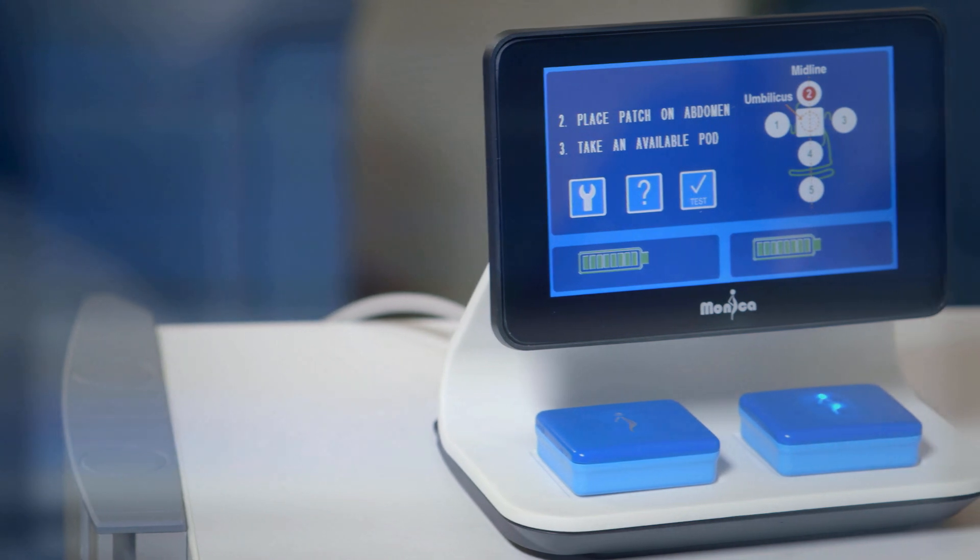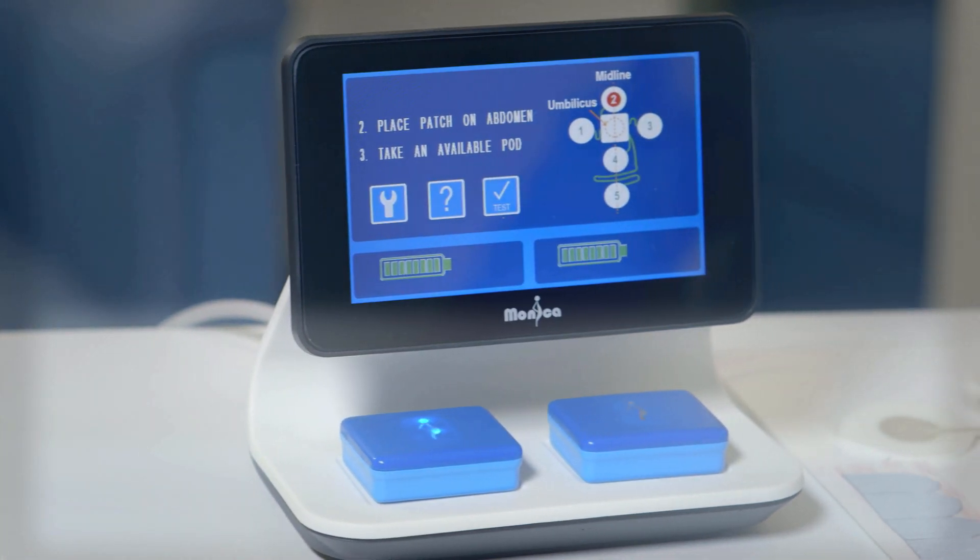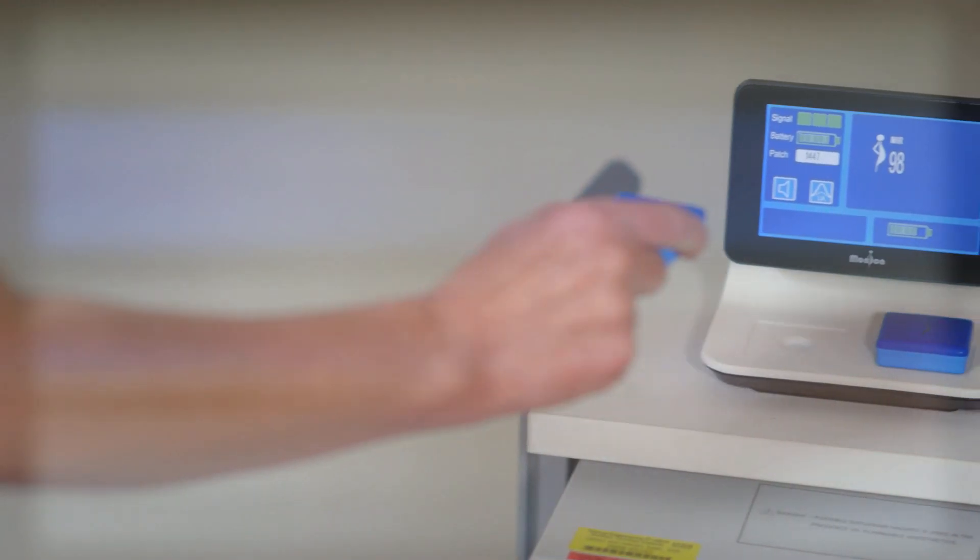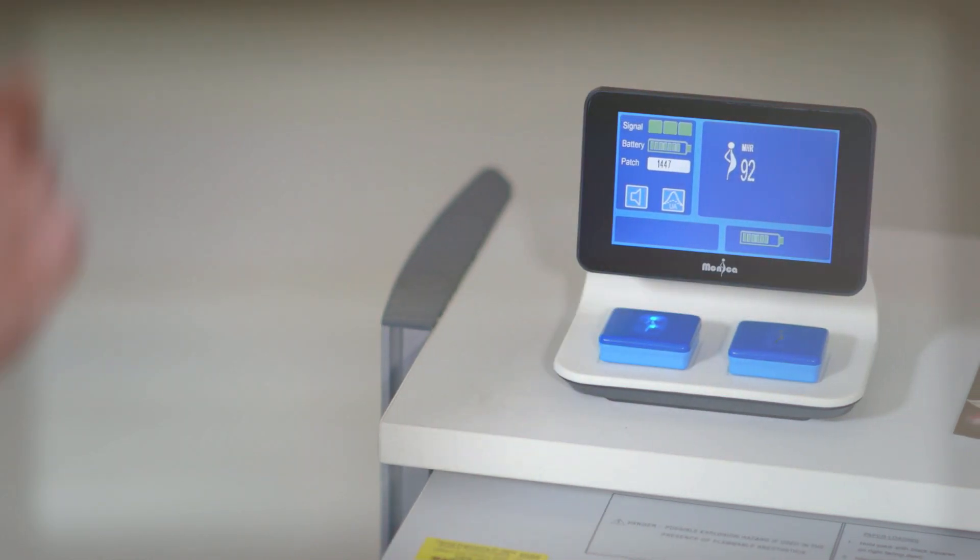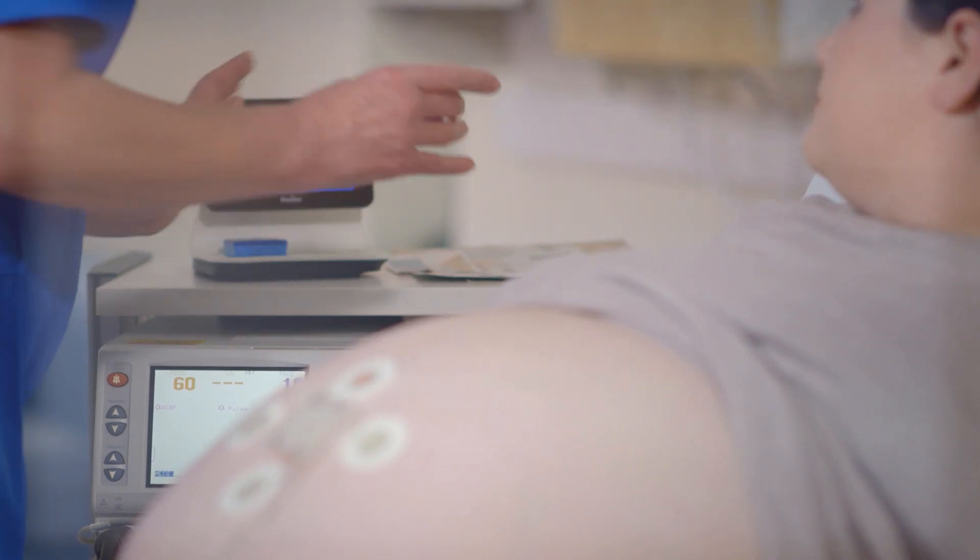The Novi interface is designed to be used with two pods, one for each charging bay. This allows you to monitor continuously for extended periods. Each pod has a battery life of up to 11 hours, and a spent pod is simply swapped with a charged pod when needed.